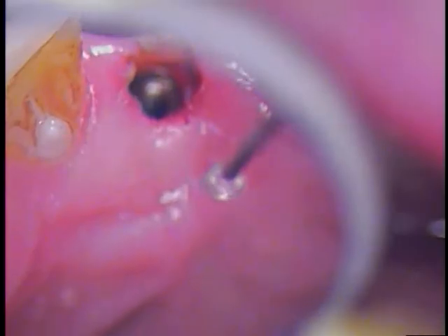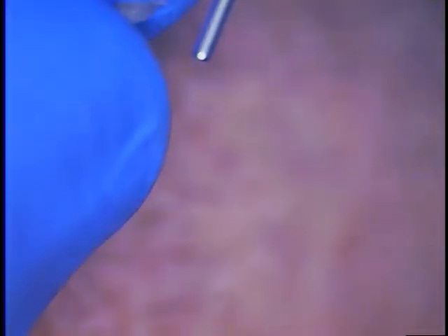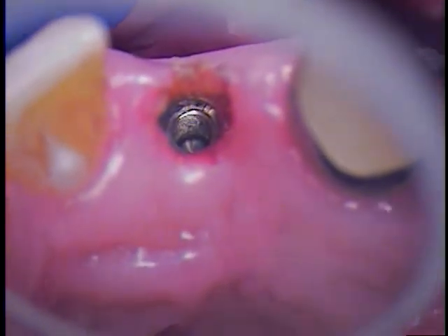Okay, got a hold of it. Oh, okay. It's something. I don't know what this is. Let's identify it. It's remnants of an earlier plastic IME. That's it. That's the tail end of one. That might have gotten left in there. Either that or it's the tail end of an impression coping. We'll keep that as evidence. Okay, that's what that is. That's interesting. Yep, that's exactly what that is.